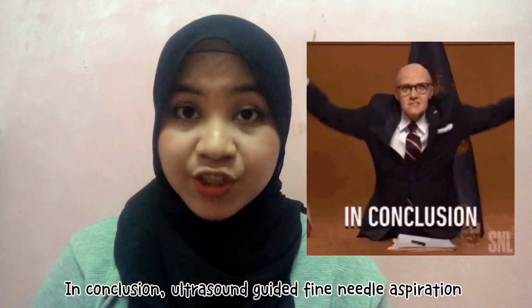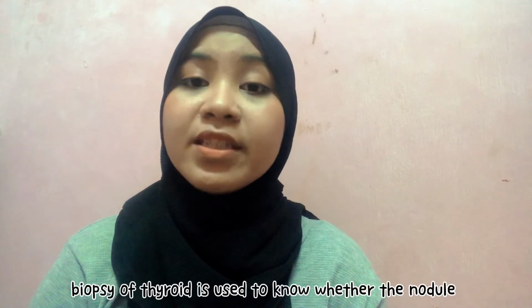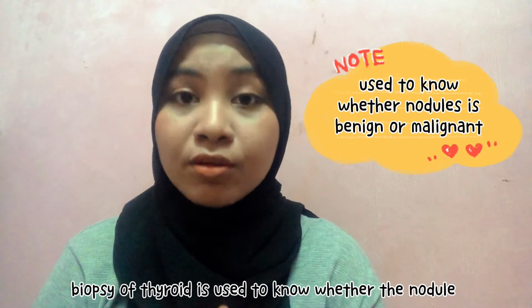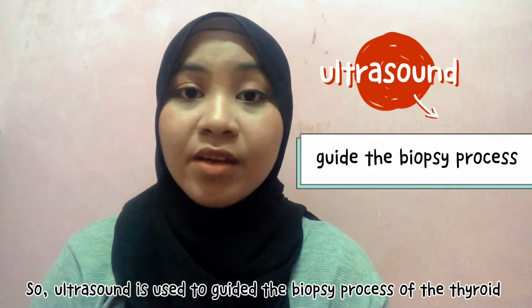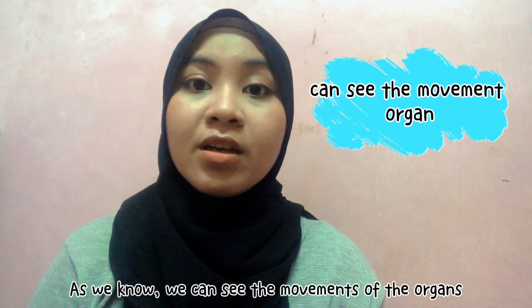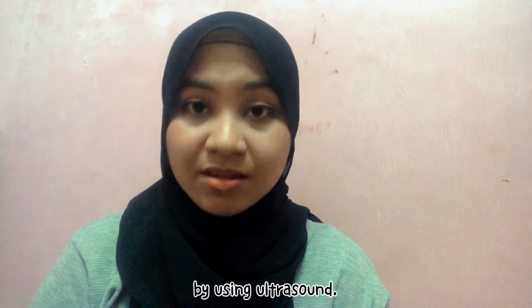In conclusion, ultrasound-guided fine needle aspiration biopsy of the thyroid is used to know whether the thyroid nodule is benign or malignant. So, ultrasound is used to guide the biopsy process of the thyroid. As we know, we can see the movement of the organ by using ultrasound.